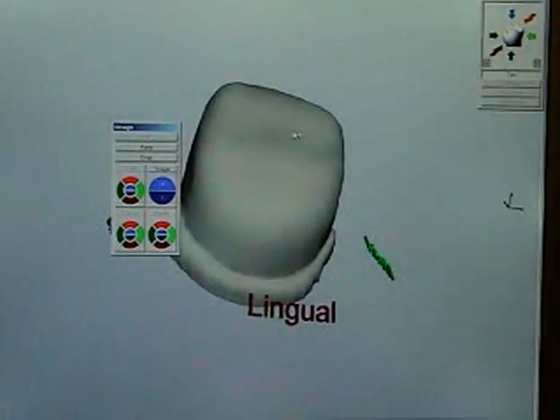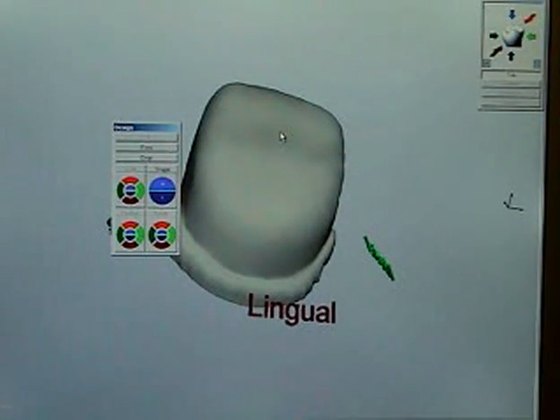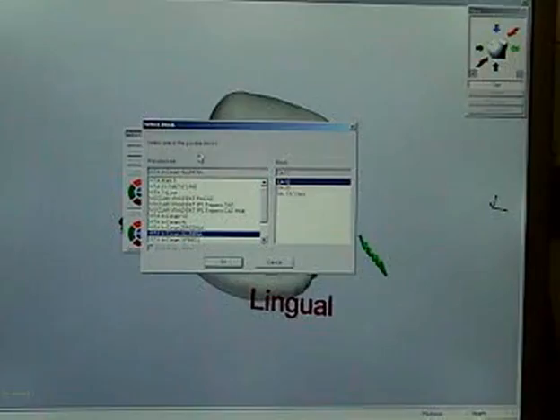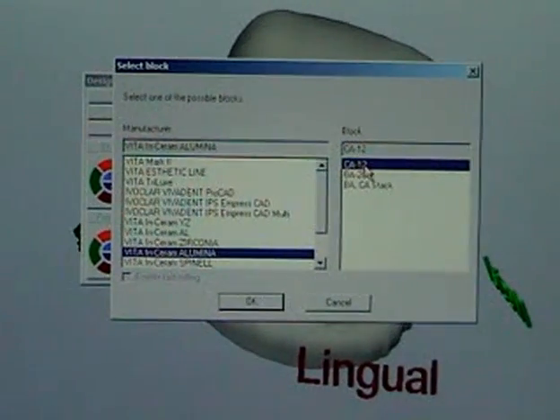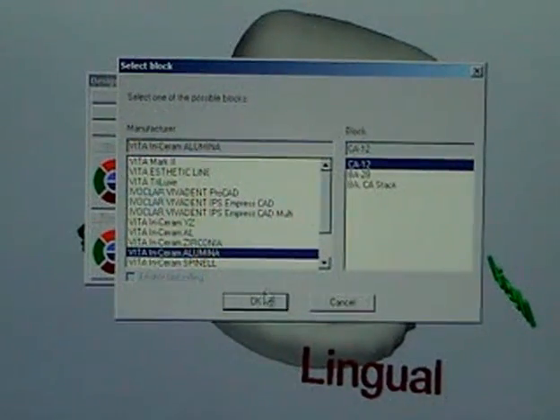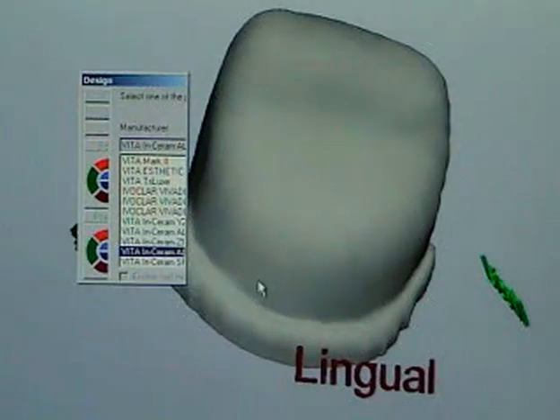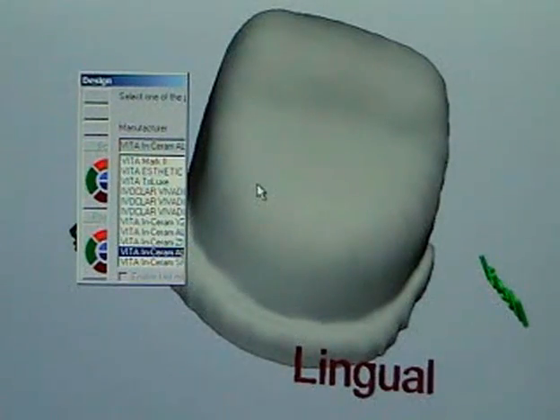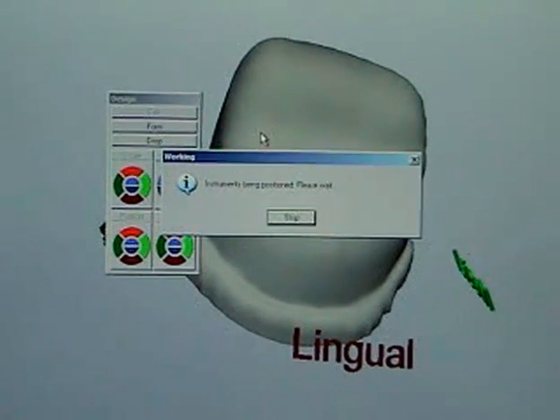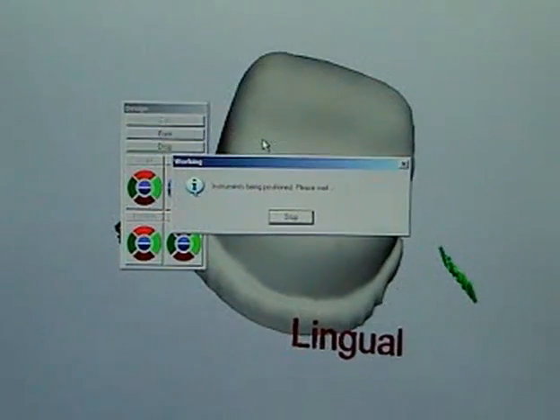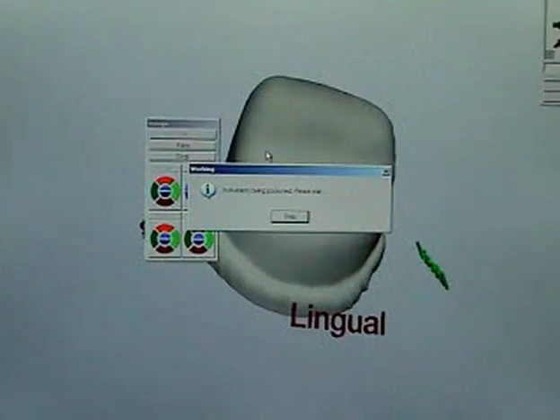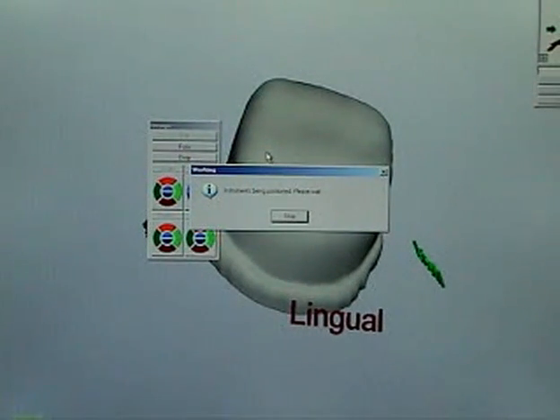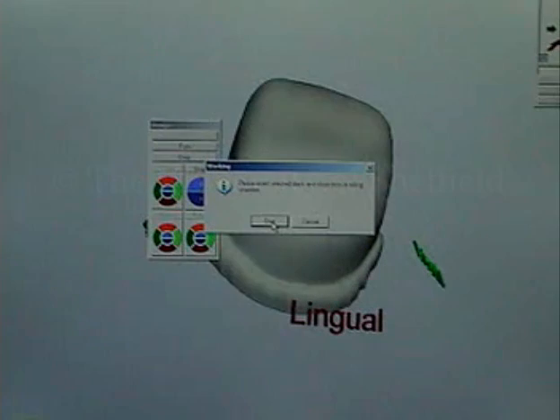So we're just picking our milling unit of where we're going to send it to and then it will tell us the size of the blank, the block that we need to mill from. So you can just about work out on the screen that it wants a CA12 which is a 12 millimetre block and then it sets the milling machine up ready for milling which will be the subject of the next podcast. Okay. Job done. Excellent.